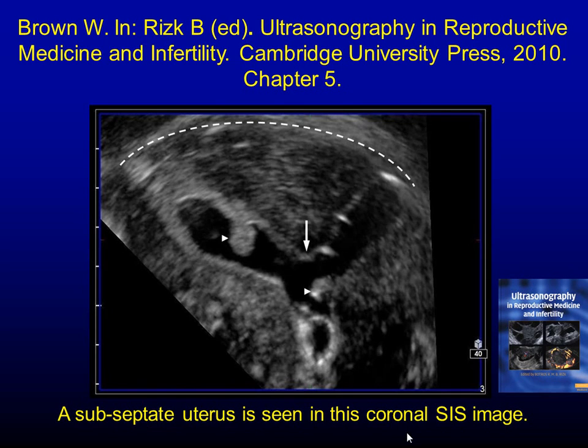This is a patient we actually did last Tuesday; she was referred from across the bay. She had 2 pregnancies on her own. She doesn't have any infertility. The first pregnancy, she miscarried spontaneously at 8 weeks. The second pregnancy, she had a missed AB, so they went in and did the DNC. The pathology came back showing no retained products of conception.